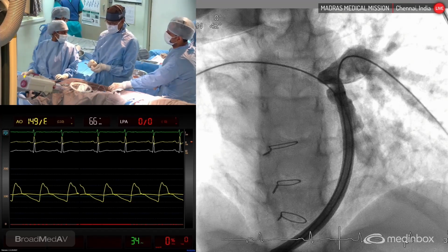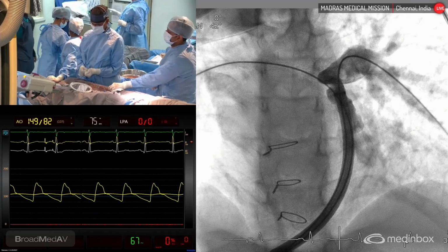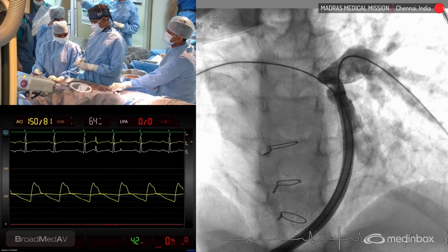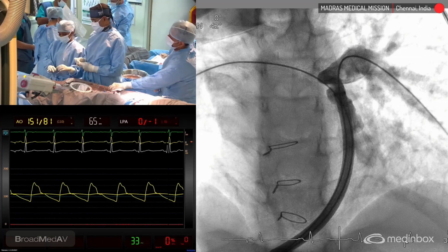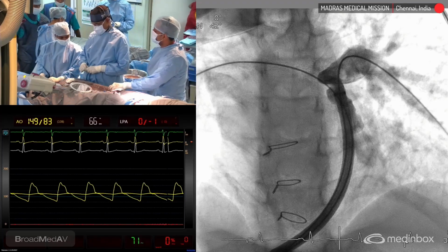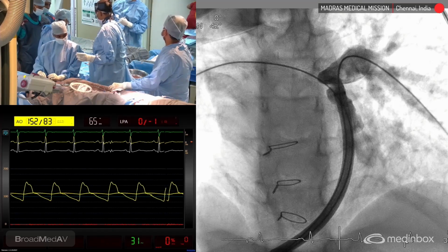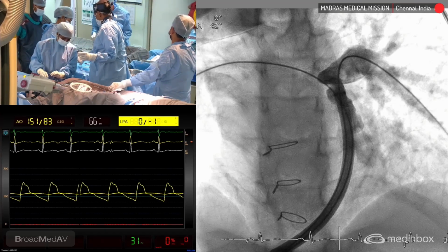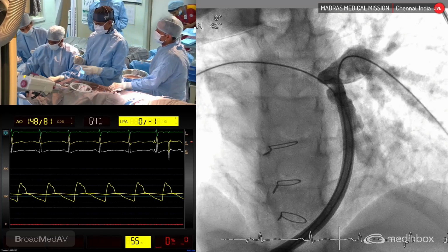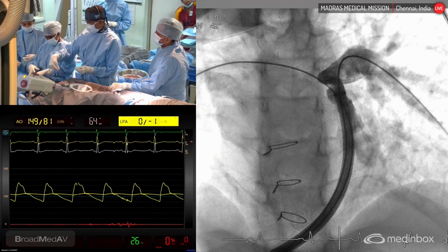We need a crimper ready. So these are the two balloons.